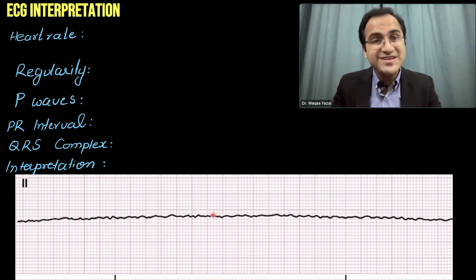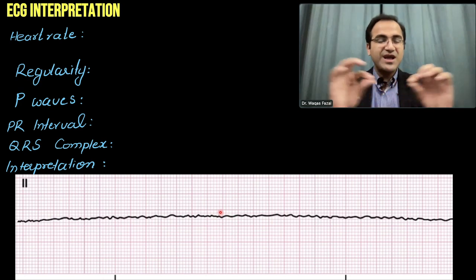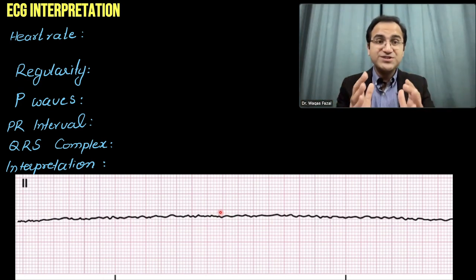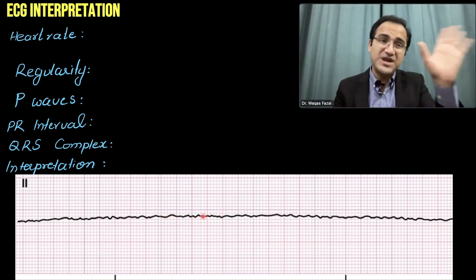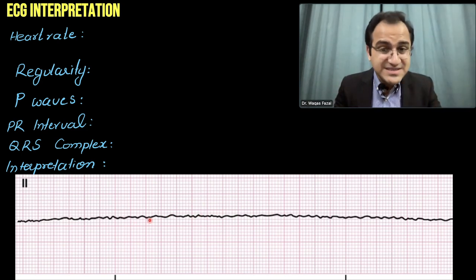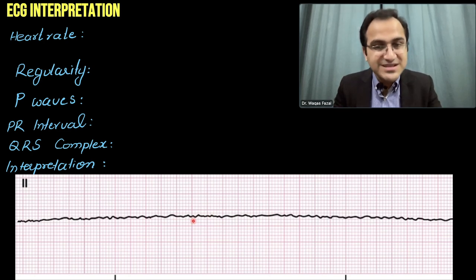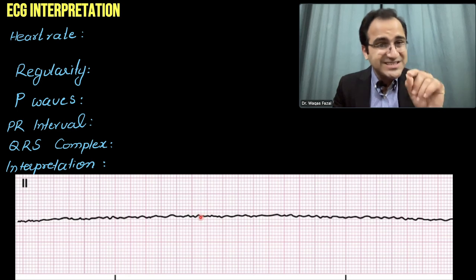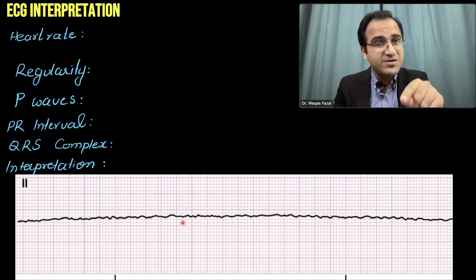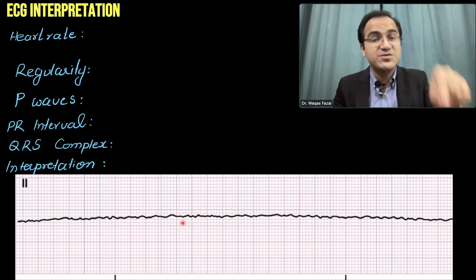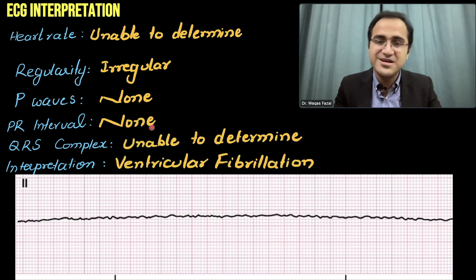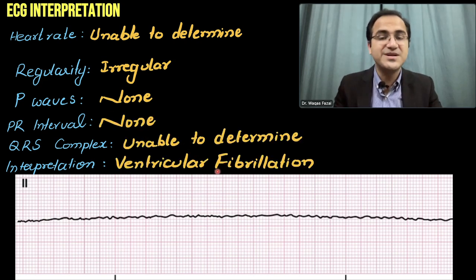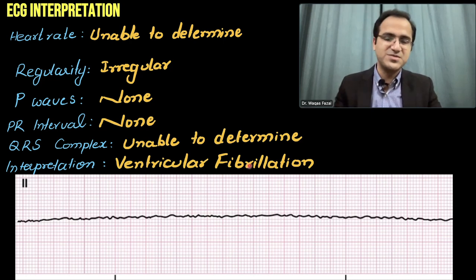This ECG shows fine ventricular fibrillation, which is more like a straight line. Remember not to confuse it with asystole — asystole does not have squiggles or bumps like these. Asystole is more like a completely flat line. These abnormal squiggles and bumps show that there is ventricular activity, and this is ventricular fibrillation. If you mark this as asystole, that will be marked wrong. Interpretation: fine ventricular fibrillation.